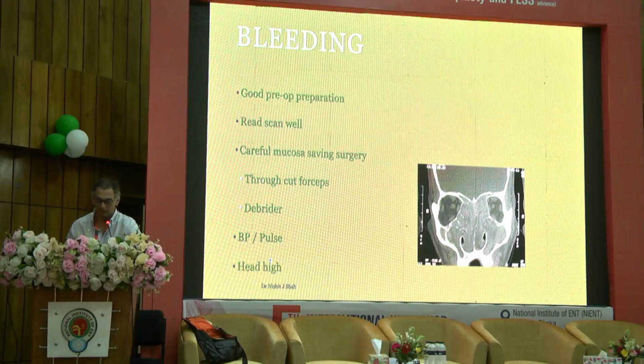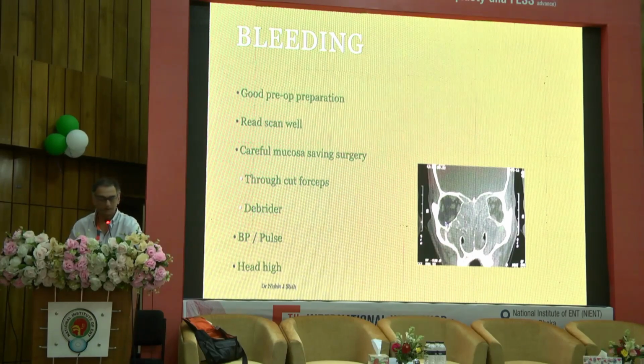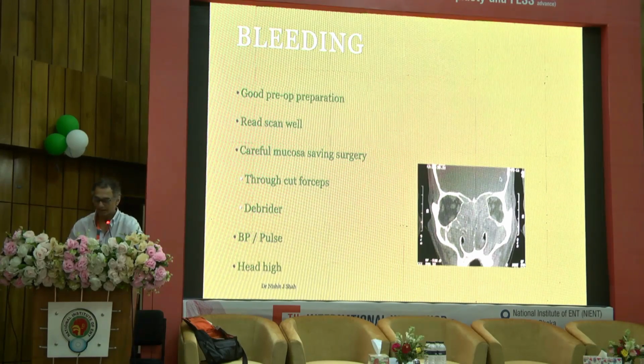Head is up about 20, 30 degrees and slightly turned towards you, especially when you're operating on the right side. So typically when you operate on the right side, you have more risk of getting a CSF leak. On the left side, more risk of getting an orbital injury.